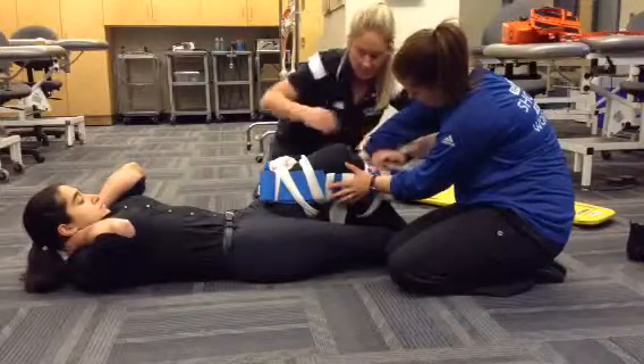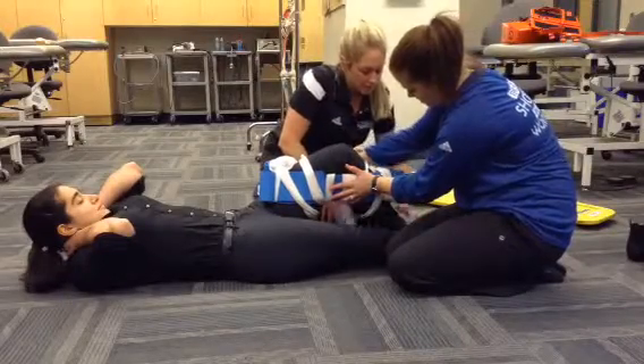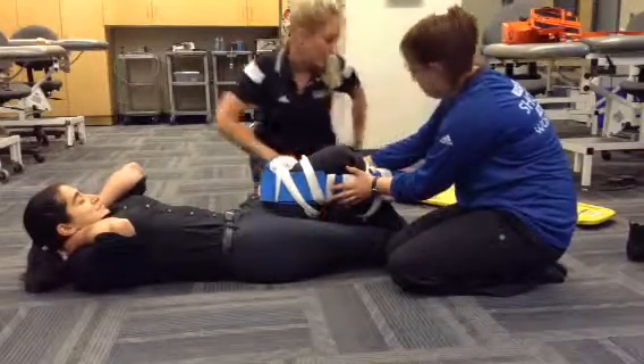We're going to check PMS again. Can you feel me touching you? Can you wiggle your toes for me? Cap refill is good.